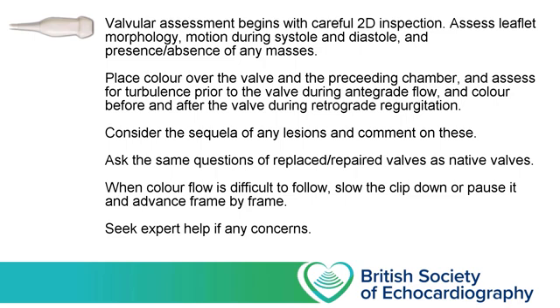When there is regurgitant flow, make sure that the jet area is covered by the box, and don't have a box that's so small that the jet area goes out of the side and we don't see how far it goes. When you do find a lesion, think what are the potential sequelae of that lesion and are they present. So comment on both important positives and negatives here.